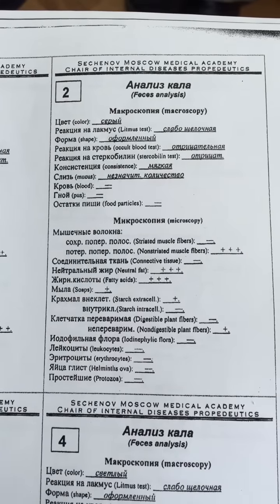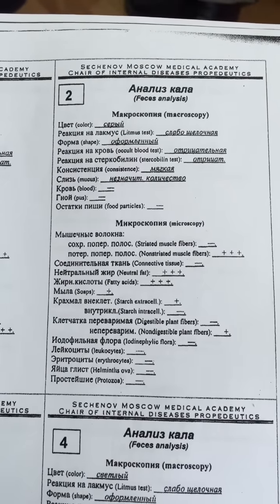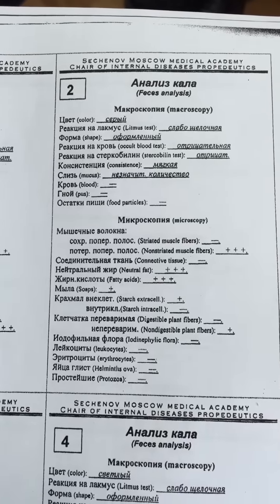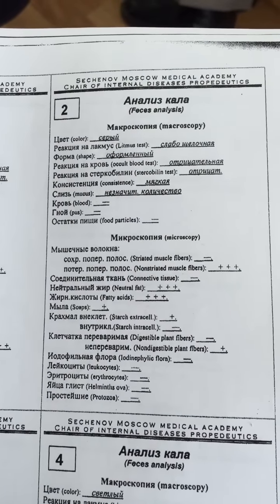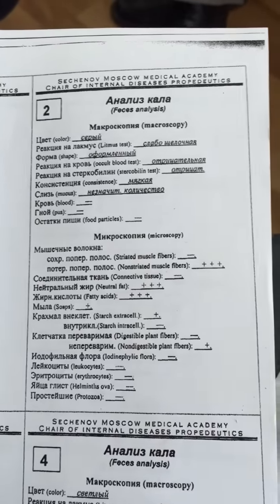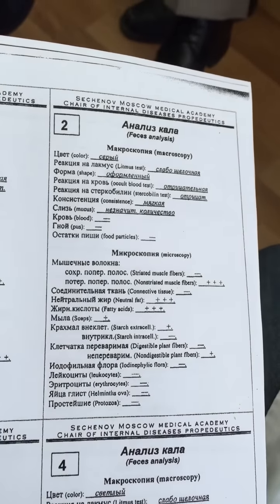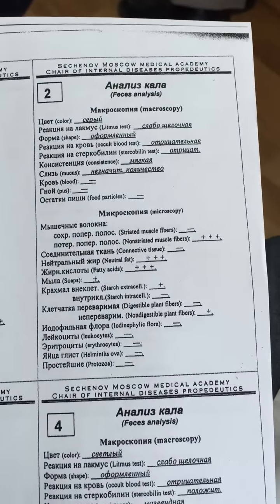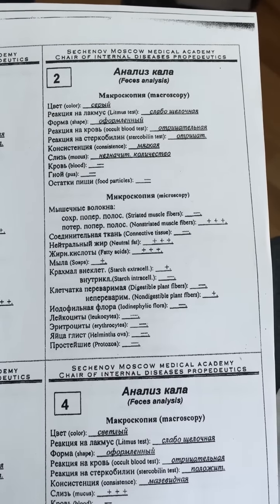We have here, besides fatty acids, also neutral fat. What does it mean? That we have, besides the mechanical jaundice, a pancreatic insufficiency. Yes, because the neutral fats we see if the pancreas doesn't produce ferments. Yes. This one is absence of lipase? Quite right, quite right.